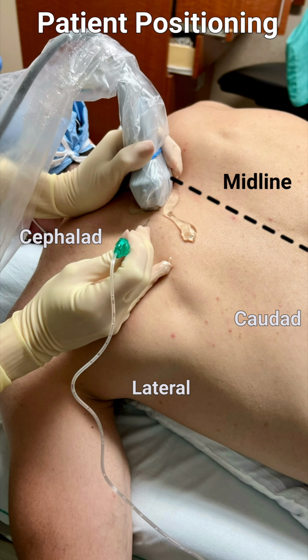My preferred positioning for all 4 of these approaches is to place the patient prone with the block side arm down and a pillow underneath the chest to move the scapula out of the way. I've found this position to be the most ergonomically effective as it allows you to steady your hand on the patient's back for improved precision and control.